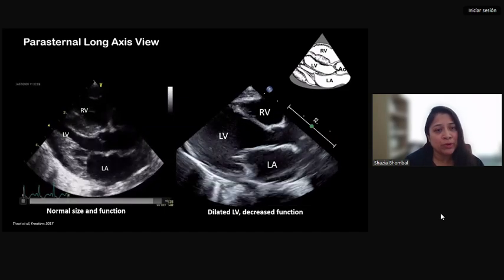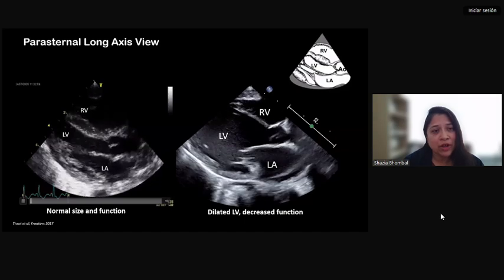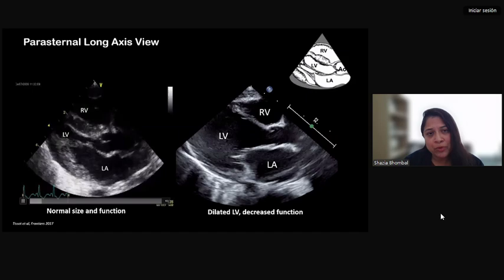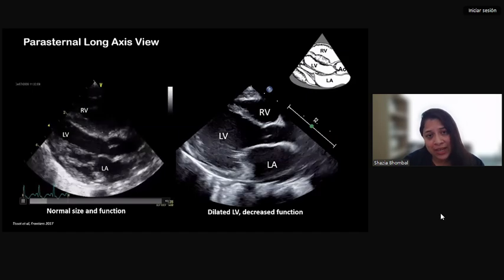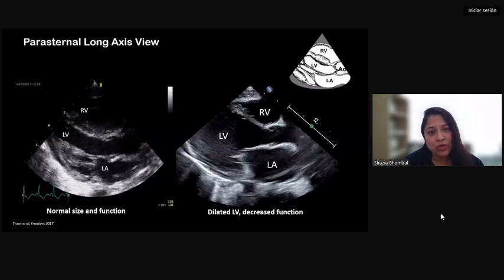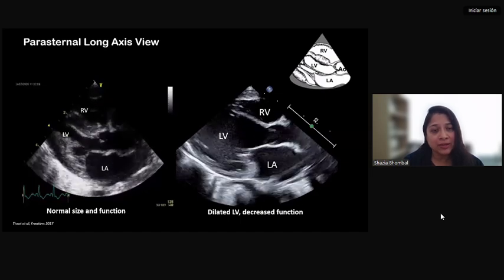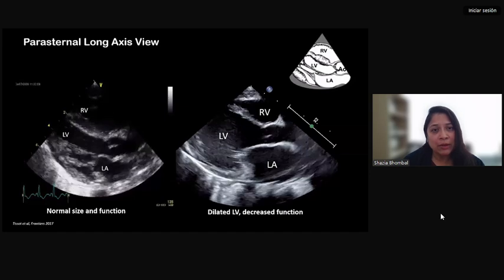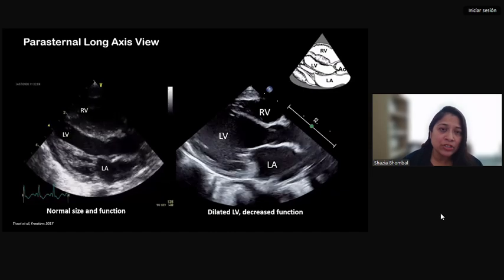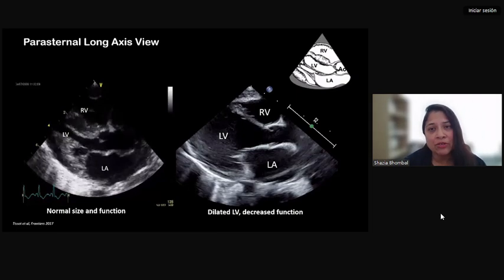When you put a probe on, you're trying to differentiate: this child is hypotensive, we're giving volume, it doesn't seem to be making a difference, or the baby's getting worse. Putting a probe on can help you differentiate. Now, we can't tell if there potentially is underlying congenital heart disease that could be impacting this. So it is also important to recognize that by putting a probe on a baby who has not had a full echo, recognizing abnormal means, again, you can triage faster and have pediatric cardiology or hemodynamics come and do a more comprehensive echo to look for congenital heart disease.